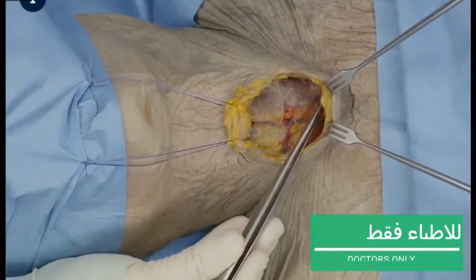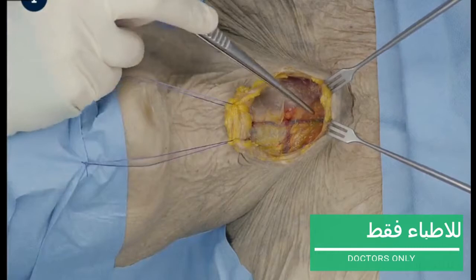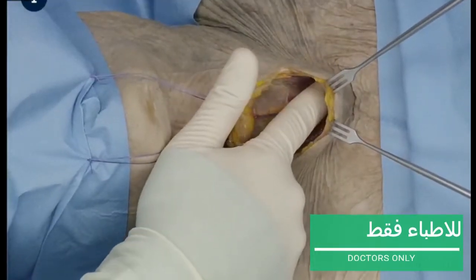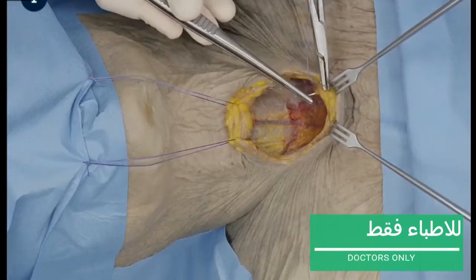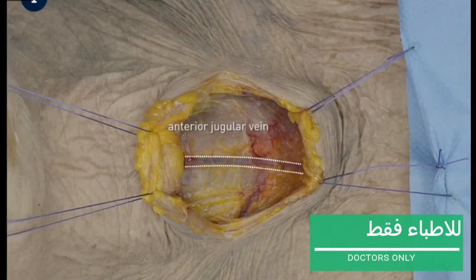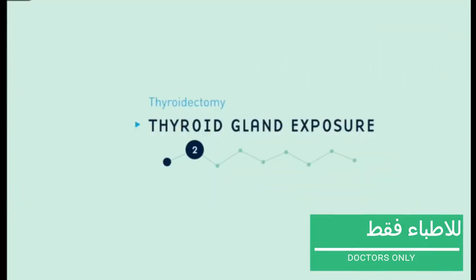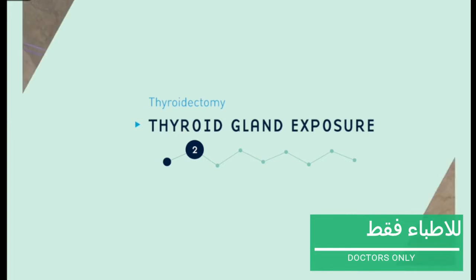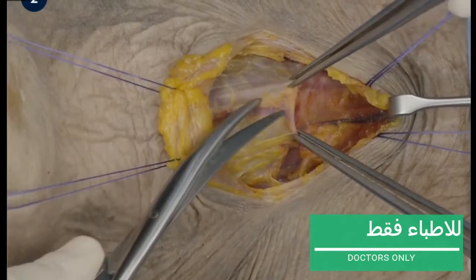The medial margins of the sternocleidomastoid muscles form the lateral borders of the surgical field. Distal dissection is continued until the clavicle and sternum are reached. This is the anterior jugular vein. The sternohyoid is split in the midline.